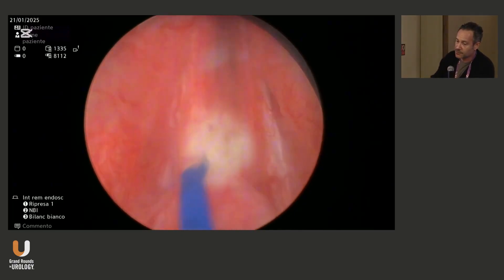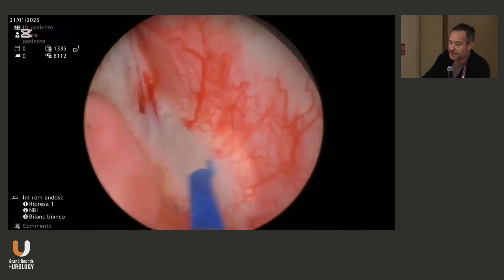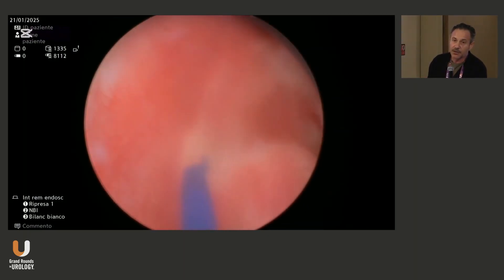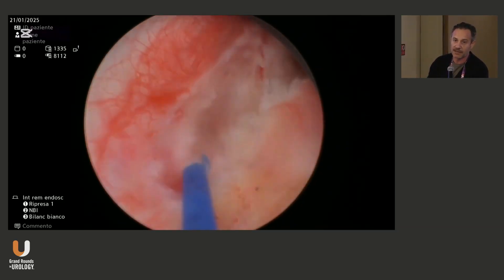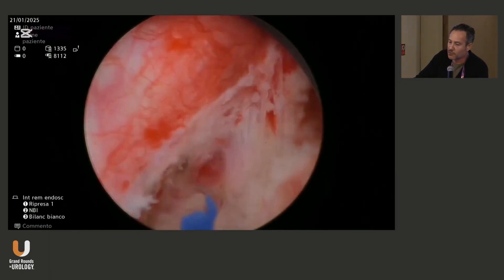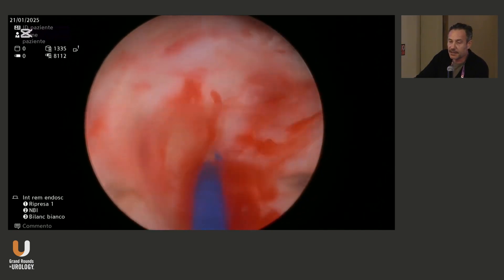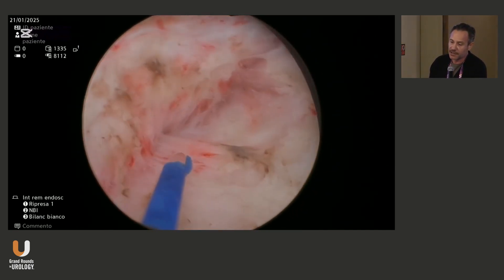Then we start with the U-shaped incision at the apex. It's a kind of no-touch technique — that's what I like to use. I preferably use the coagulation mode, very low power energy, 30 to 40 watts. You can control small bleeding this way. And then the idea is to go straight to find the anatomical plane for enucleation.